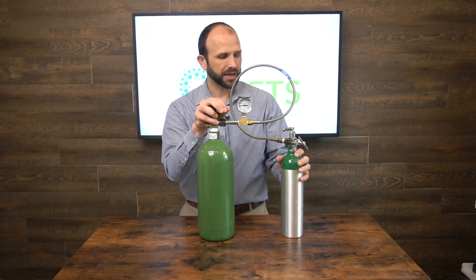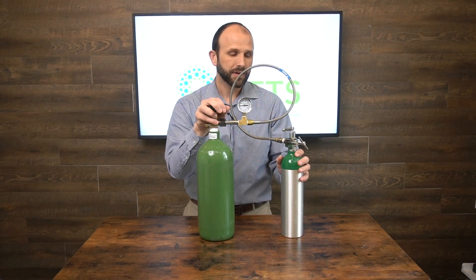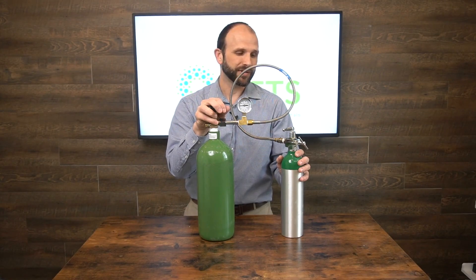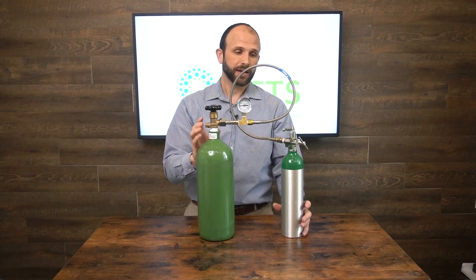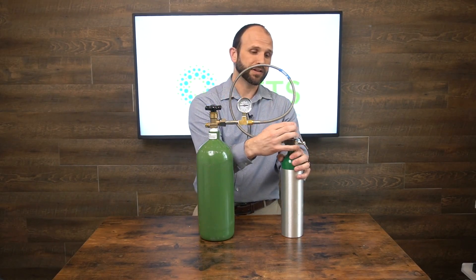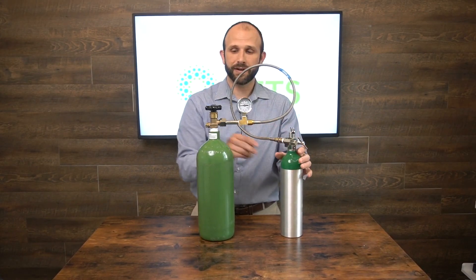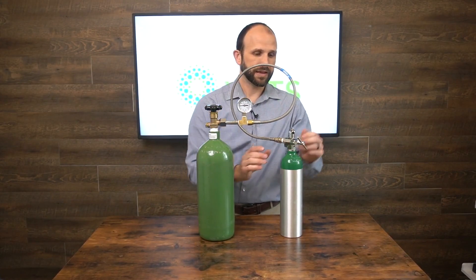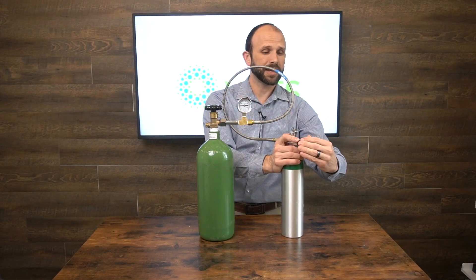Depending on the size of the tank, it'll take 20 to 30 seconds — maybe up to a minute if you do it really slowly. You'll actually feel the tank heat up as the oxygen goes in. To shut this process down and remove the transfill hose, shut both tank valves, and then you'll hear some oxygen escape — that's normal, don't be freaked out about it.